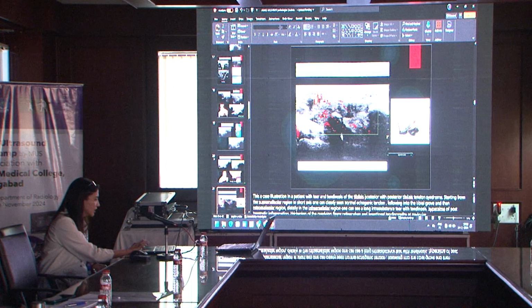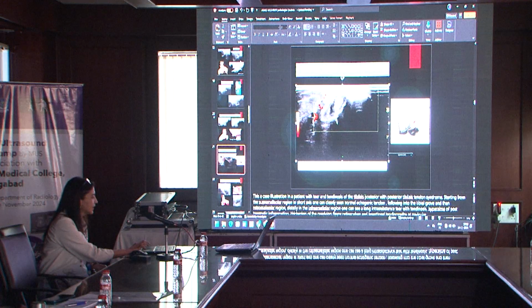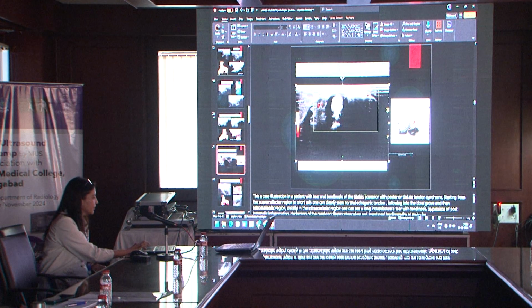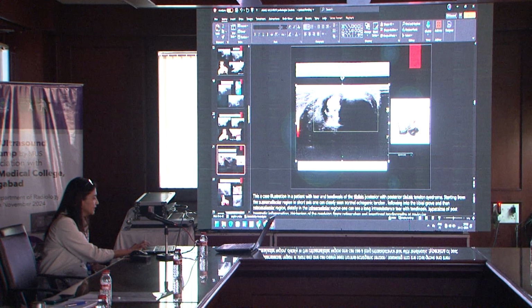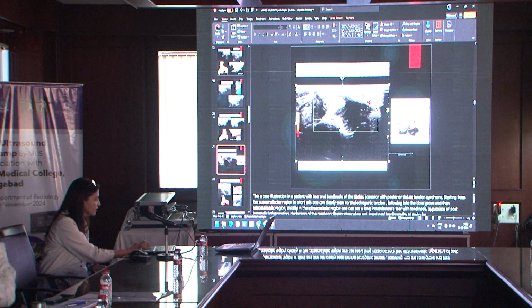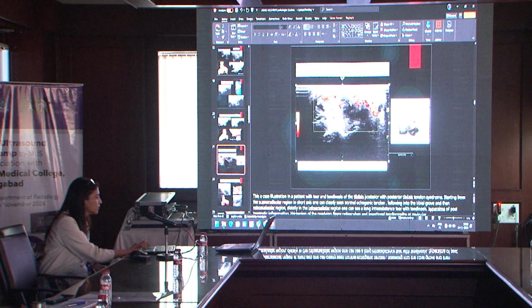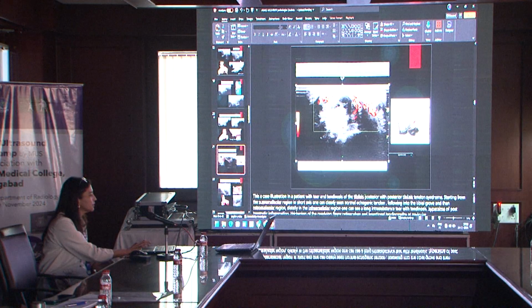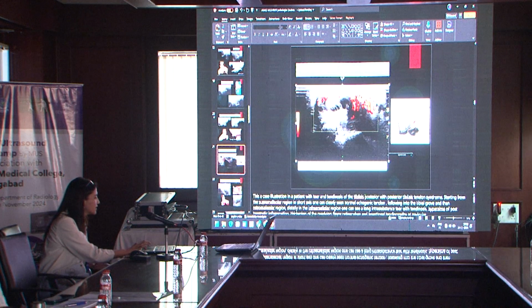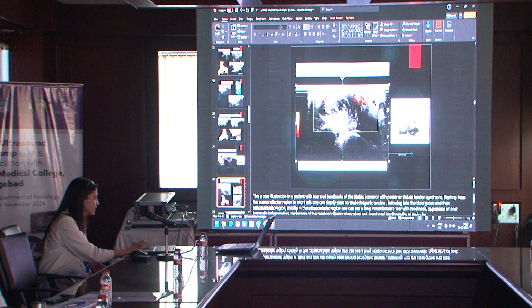This is a case of injury. So, what we saw here, we will just have a look at this clip, that is the tibialis posterior. As we come down, we see that there is a lot of vascularity, there is fluid around the tendon, and can you see in this tendon what is happening? It is torn. So, there is some intratendinous tear and increased vascularity, and the retinaculum also shows vascularity. So, this is a tibialis posterior syndrome, where the entire compartment is tight with so much vascularity.